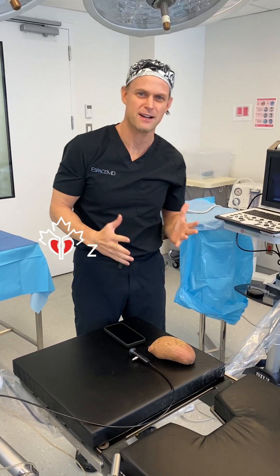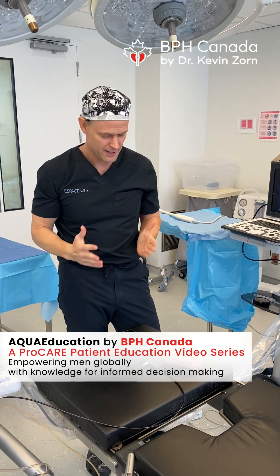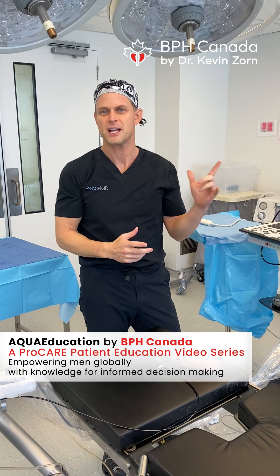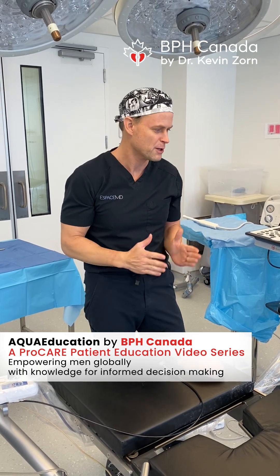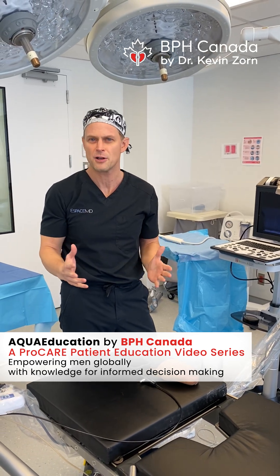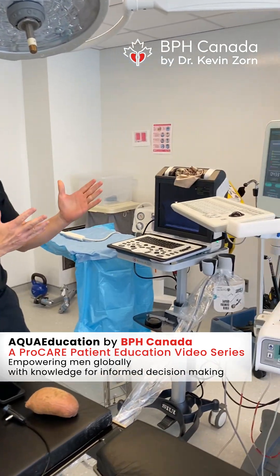Hi, Dr. Kevin Zorn here from BPH Canada, home of our Aquablation Centre, surrounded by my team. We've already done some demonstrations of the technology at conferences to show other urologists. But we thought, let's show you the viewer — the patients, the family members — looking at what is this technology, how powerful is it, how precise is it. So come over here, I'll show you our design.